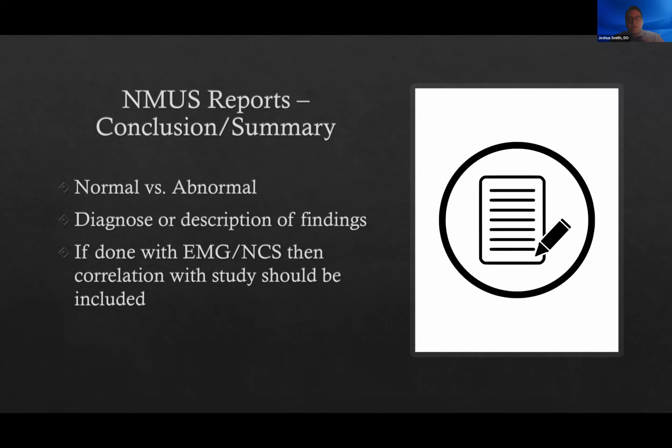So just make sure you are not over diagnosing or being so certain of what it is. You might say, I'm seeing this cystic structure approaching it. It's most likely this, but I can't rule out these things. It's like when you get those radiology reports, right? You read them and it says, well, clinical correlation required. You get an MRI report and it says it's most likely microvascular, but then it lists 5, 10 other things and says you have to correlate clinically. You're going to be doing the same thing when you're doing ultrasound.